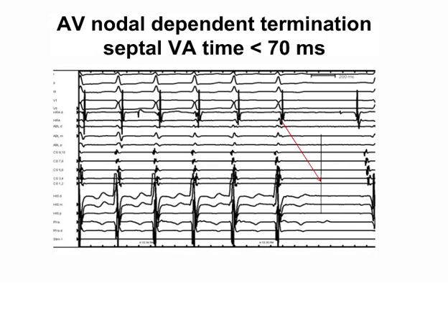So atrial tachycardia is not going to do that. If it's been 1-to-1 the whole time, it's very, very unlikely atrial tachycardia terminates at the same time you produce conduction block in the AV node. So this proves it's AV nodal dependent, it rules out AT, and it rules out ORT because the VA time is too short. So this type of finding, you didn't do any maneuvers, but you know the diagnosis.